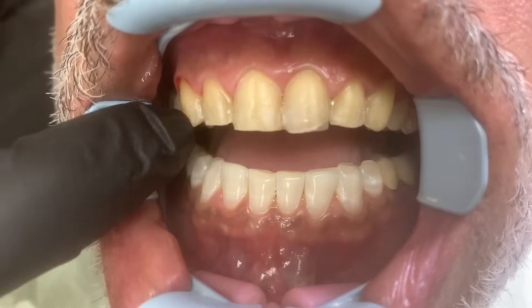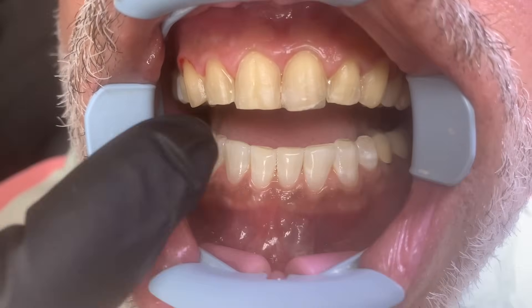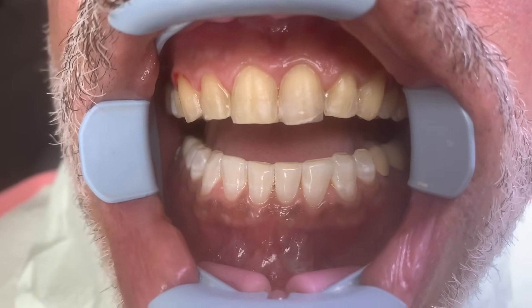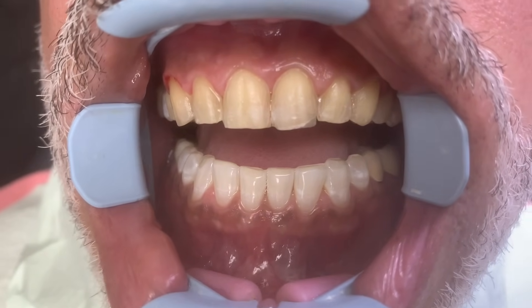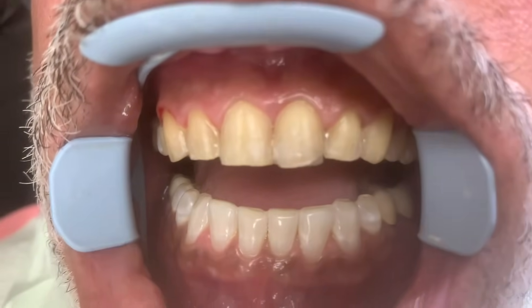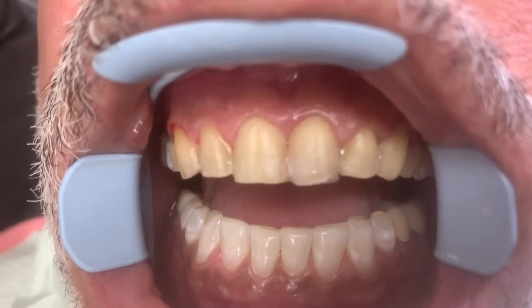Today we are going to show you a beautiful veneer case. These are minimal prep veneers — we have already prepared the teeth, and you can see we do not cut the teeth down. A lot of viewers have asked about that, which is why they don't want veneers. But these are very minimal prep, with very little sensitivity, and the patient didn't really have to be numb. It's really the patient's choice.